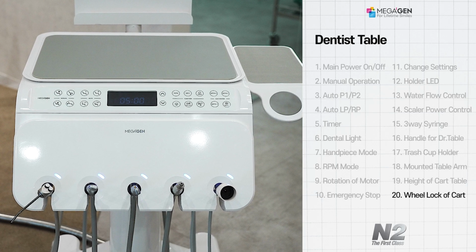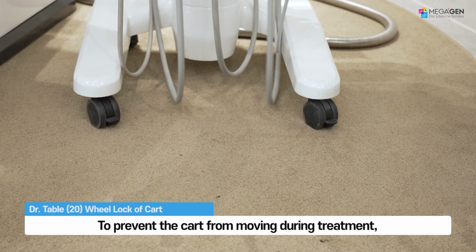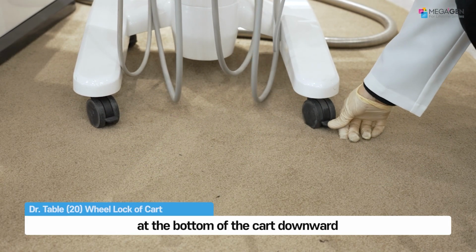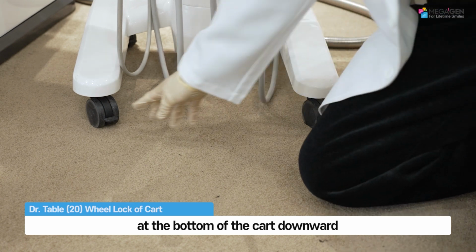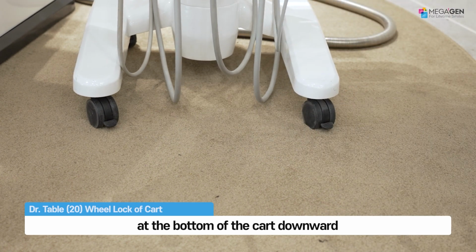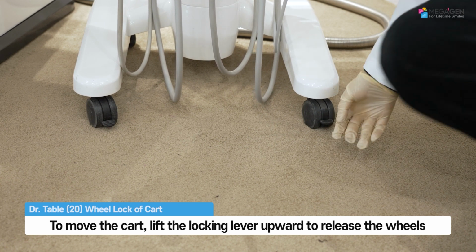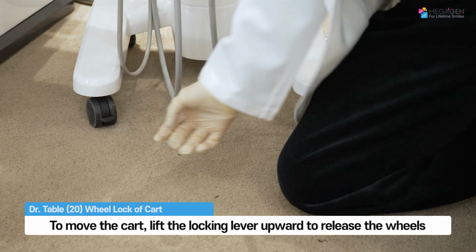How to lock the cart wheels. To prevent the cart from moving during treatment, push the locking lever on the wheels at the bottom of the cart downward. To move the cart, lift the locking lever upward to release the wheels.